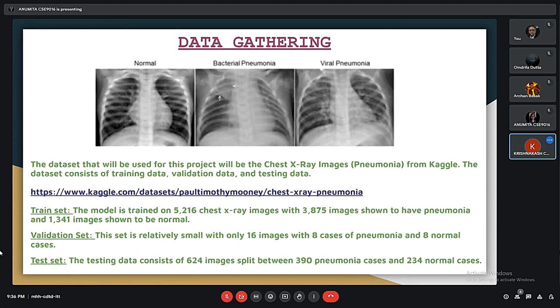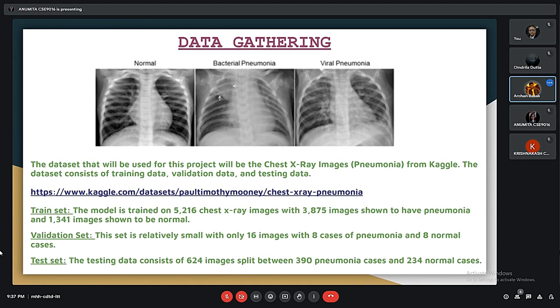As we can see, these are the X-ray images of normal, bacterial pneumonia, and viral pneumonia. We have a dataset from Kaggle that contains three sets: training set, validation set, and test set. The training set contains 5,216 chest X-ray images, with 3,875 images having pneumonia and the others being normal. The validation set is relatively small with only 16 images — eight cases of pneumonia and eight normal cases.